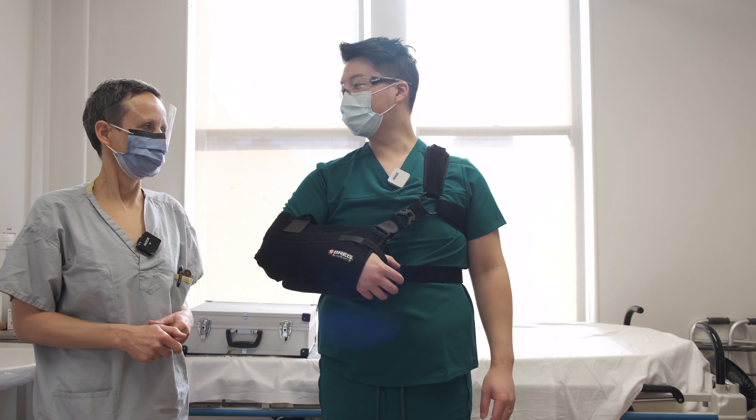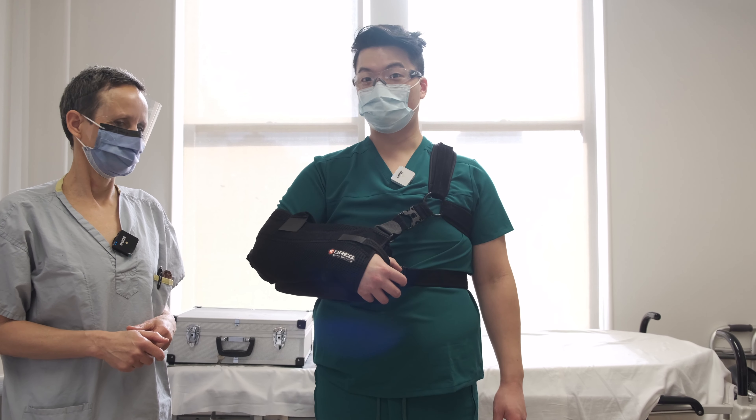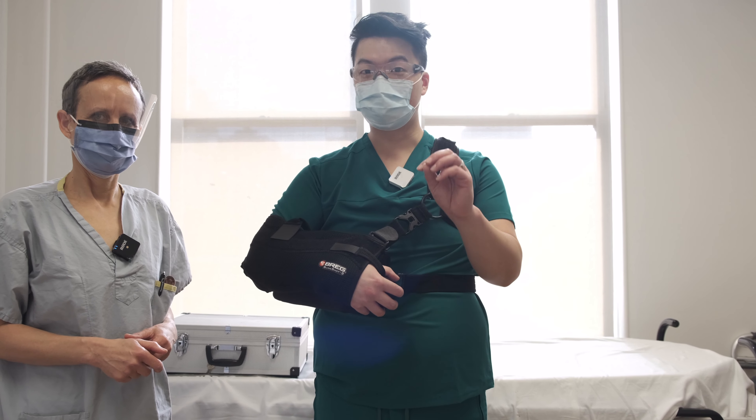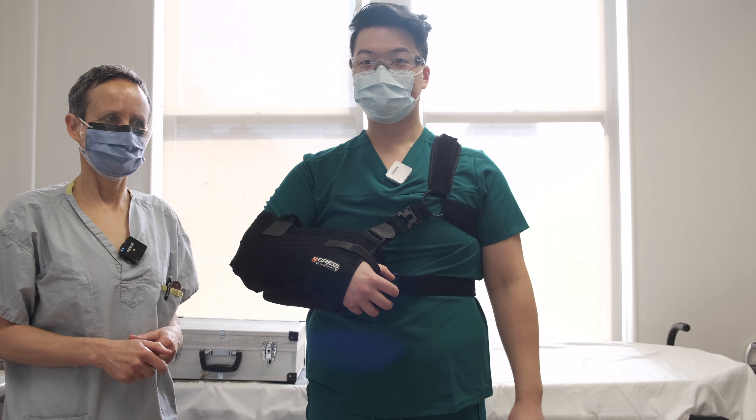That's about it. Thanks, Marianne, for the breakdown. This is how you size and fit a shoulder abduction sling. If you have any questions, make sure you ask your healthcare provider. Thank you. Bye.